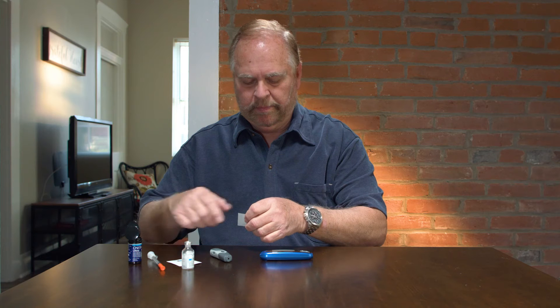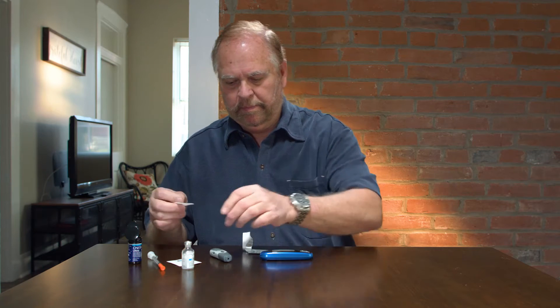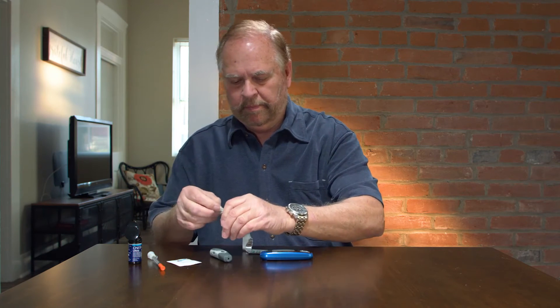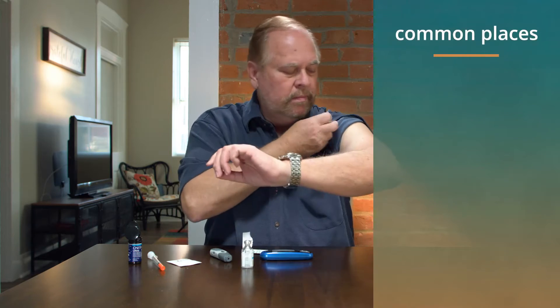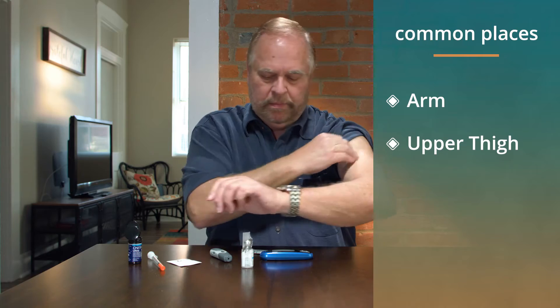Open an alcohol swab and swab off the top of the insulin bottle and then the area where you intend to give yourself the injection. Common places are the arm, upper thigh, and stomach.